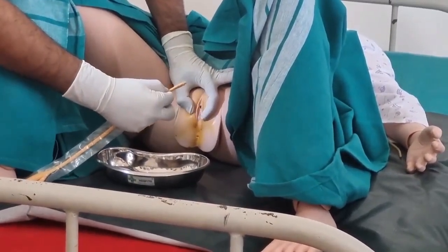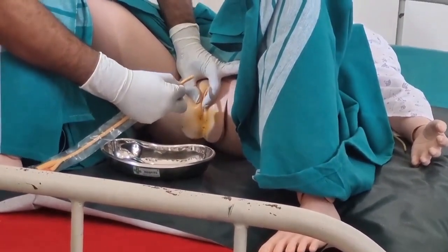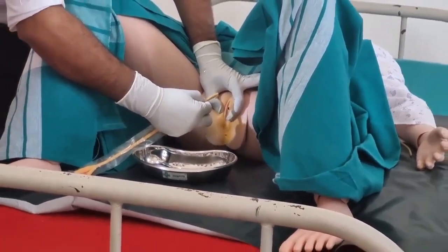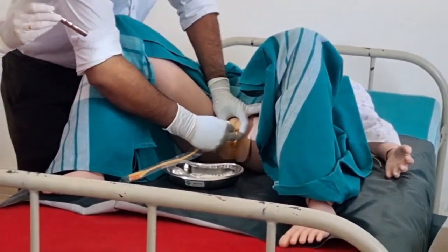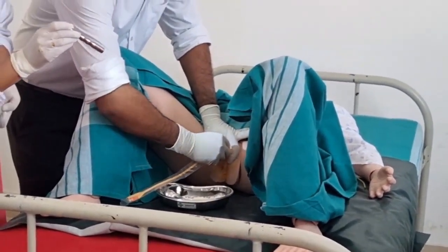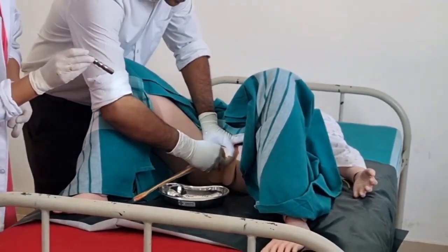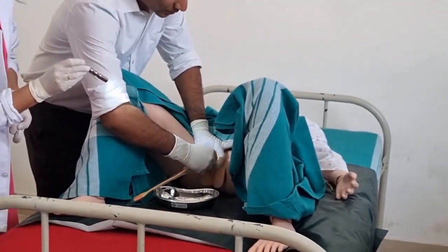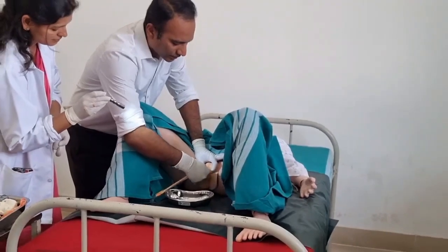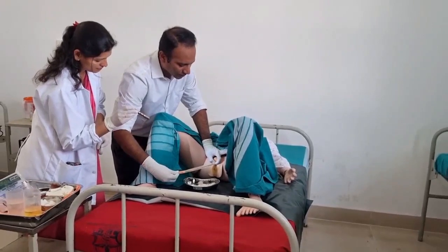See, once you differentiate the vaginal opening, above that you can find the urethral orifice or urethral meatus, urethral opening also you can say. Just insert it gently. Okay, you can insert up to 4.5 centimeters or even 5 to 6 centimeters also. Okay. So after that, I am going to remove the remaining part of the cover.